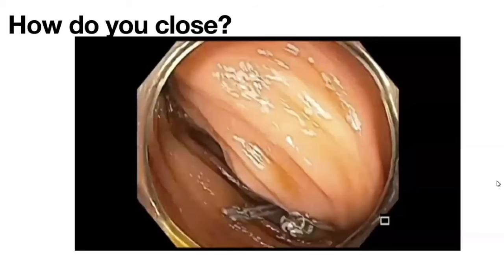And I do the same thing when I go to the hepatic flexure, another flush, because if you put it into the hepatic flexure or proximal transverse colon, and the patient is lying on the left lateral position, the simethicone will come down the transverse colon again into the splenic flexure. As it comes down, it clears up.